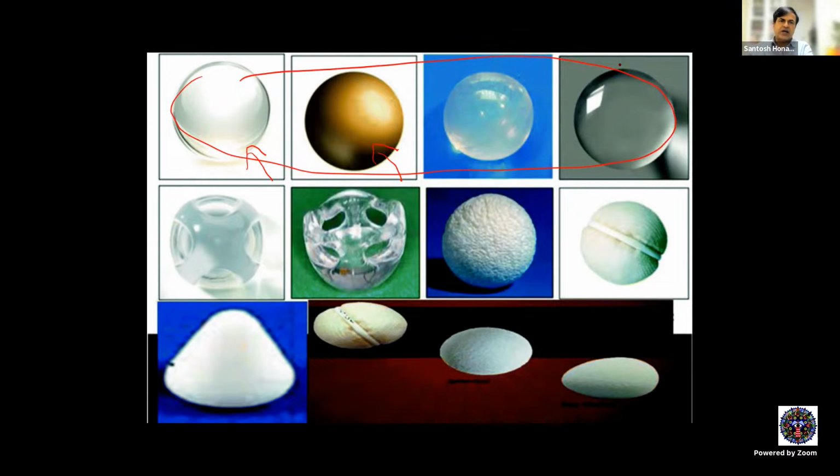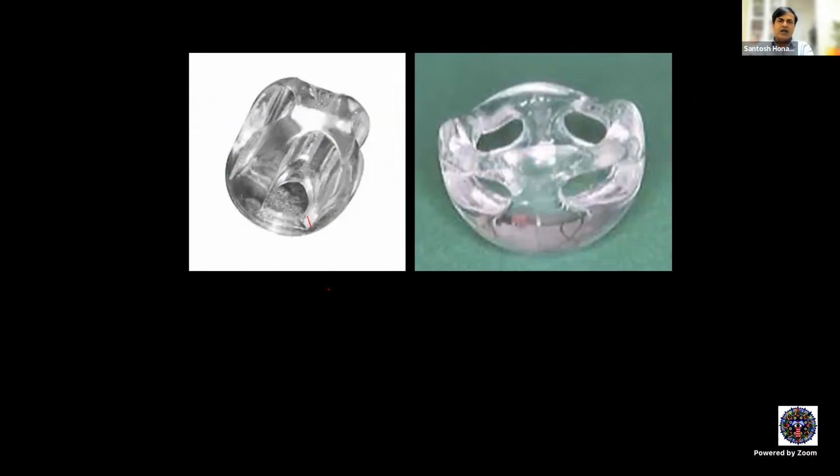So these are classically non-integrated implants. Whereas this is Castroviejo implant and this is Allen's implant. So what does this have? See, this has these fenestrations for passing extraocular muscles, right? So after having enucleated, you have these extraocular muscles.